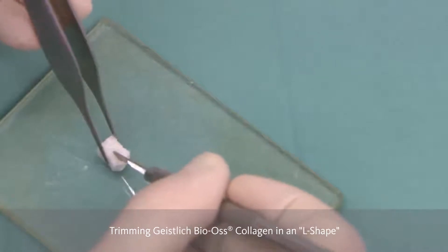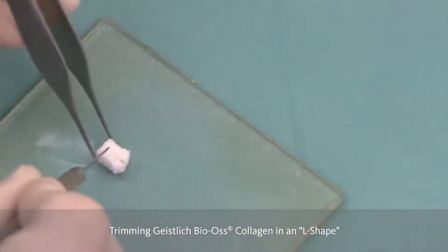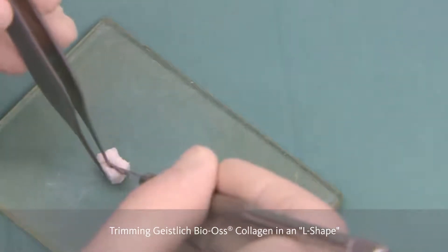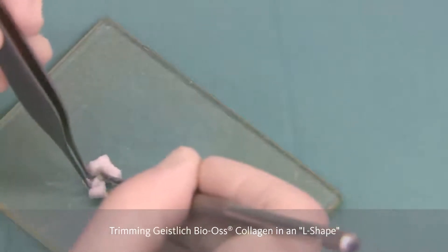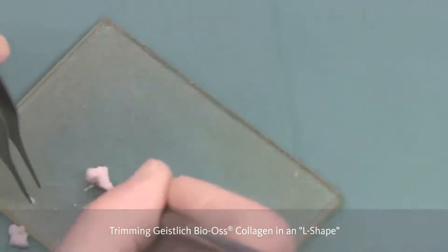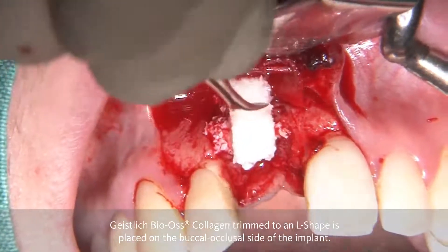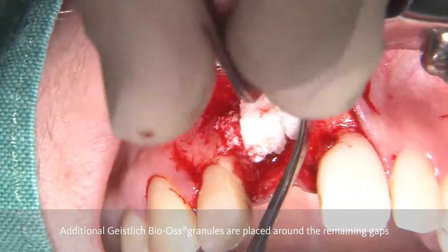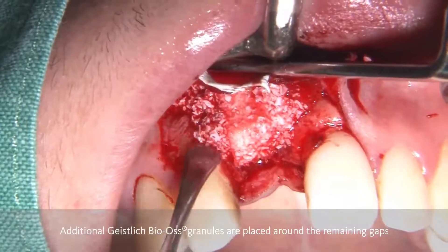We do this when the Bio-Gide collagen is wet, as it becomes a little bit easier to cut. We cut it into the correct dimensions using a blade. This L serves different aims: on the one hand, we would like to have more contour on the buccal aspect, mimicking the root prominence. On the other hand, we would like to support the soft tissue in the vertical part, primarily for prosthetic and aesthetic reasons. The buccal part is meant to turn into bone, and the coronal part on top of the implant is primarily there to support the soft tissues.